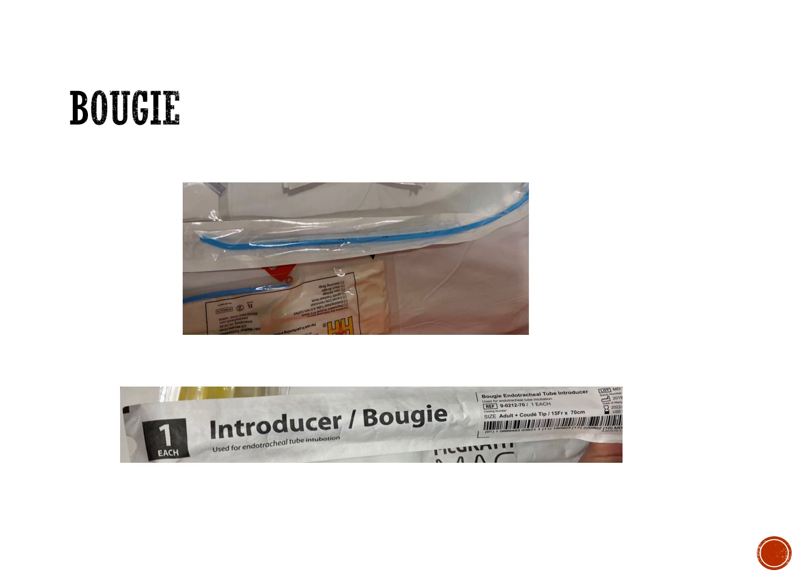The idea is it would be easier to introduce through the glottis, but also so that you may be able to detect the cartilaginous rings, where the tip of that angle is now kind of deflecting off the cartilaginous rings, which you'll find in the trachea, but you will not find in the esophagus. And then once that's through the glottis, you could thread the endotracheal tube through the glottis, put it in place, and take the bougie out. Inflate the cuff, start ventilating the patient, confirm proper placement, end tidal CO2, etc.